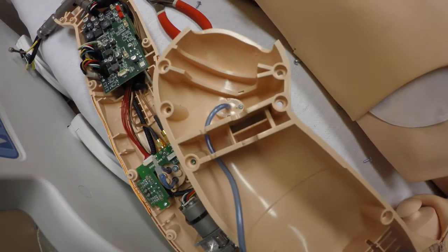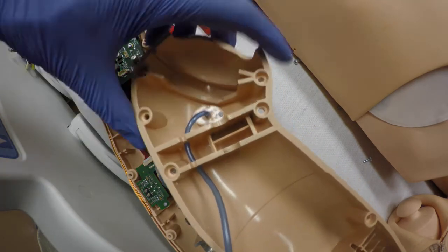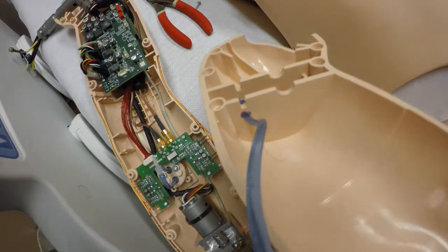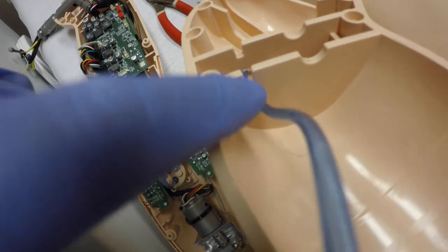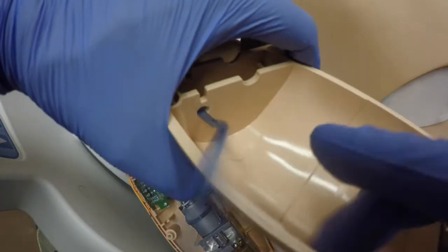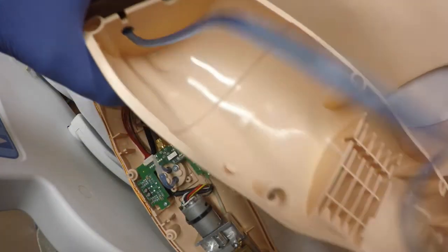I drilled two holes. I used a 7/32 inch drill bit — you can also use a quarter inch but that worked the best. You can see I drilled the hole right through the little part where it would normally lie, to hold it in place on both sides. That'll allow plenty of room in there for the hose to expand a little bit, as opposed to here where it's pretty snug.